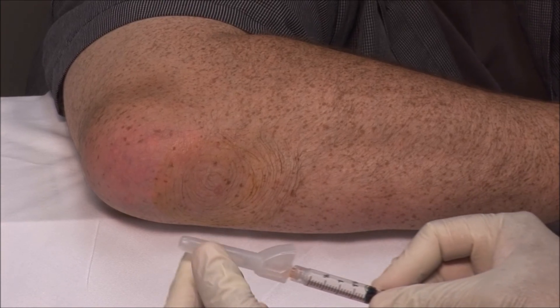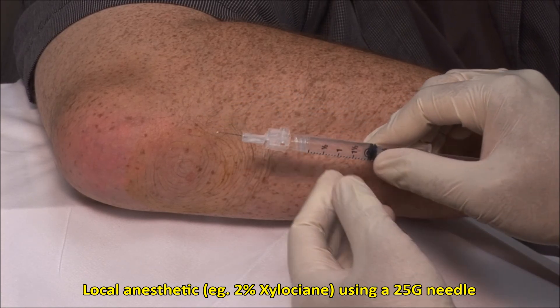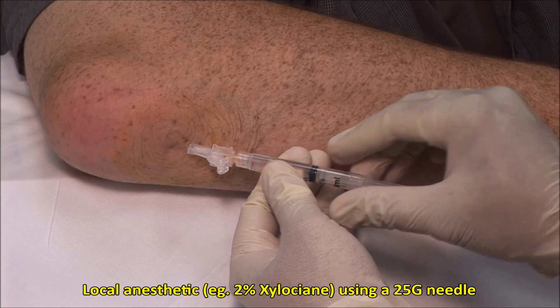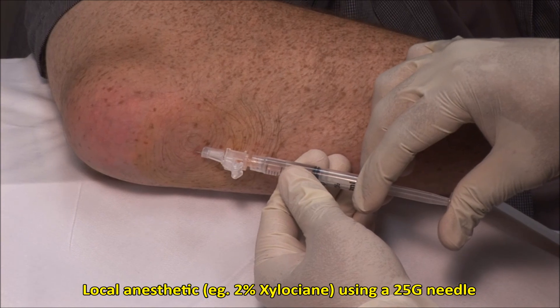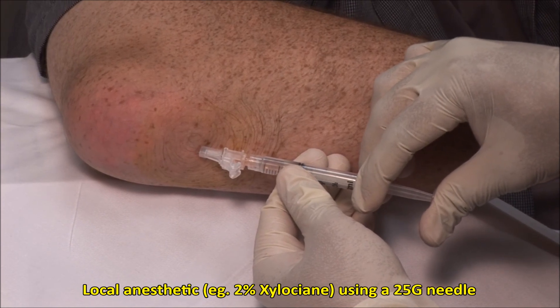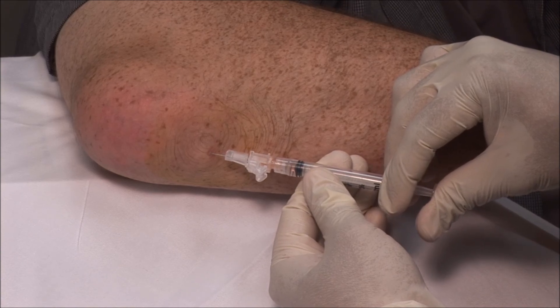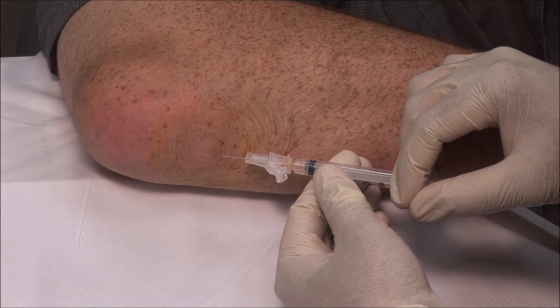Using a 25 gauge needle, apply local anesthetic subcutaneously and towards the bursa. You can use 1-2 ml of 2% xylocaine. Give this a couple minutes to take effect.